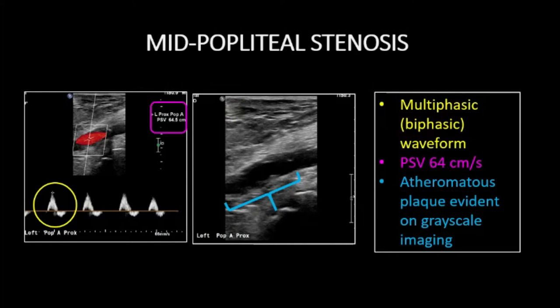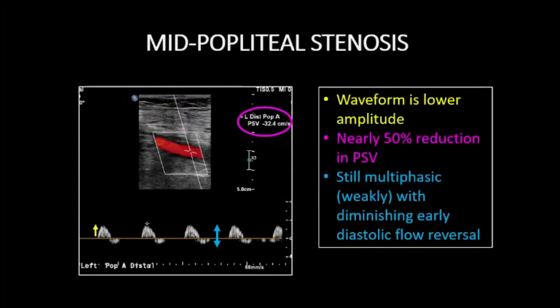With approximately 50% stenosis, the waveform in this popliteal artery is multiphasic but has lost the final antegrade flow signal due to loss of arterial compliance, causing a biphasic appearance. The spectral tracing maintains the expected late diastolic absence of signal. Grayscale imaging confirms the presence of plaque with luminal compromise, and stenosis can be approximated at 50% based on the waveform and grayscale appearance of the lumen.